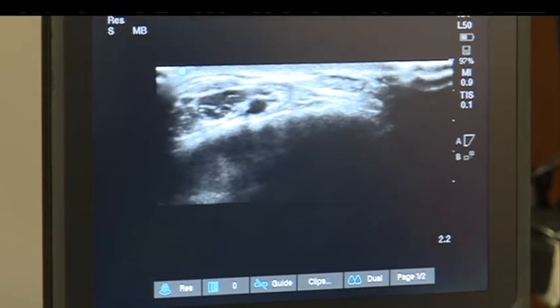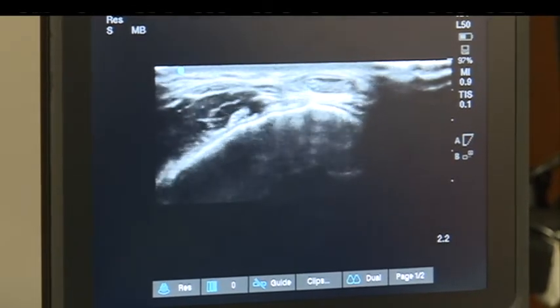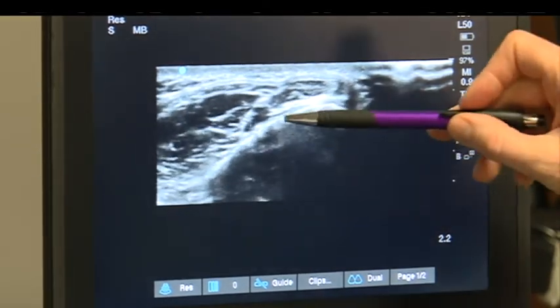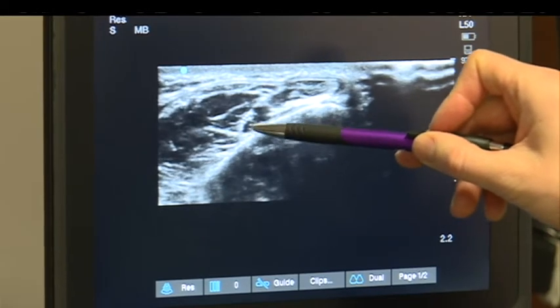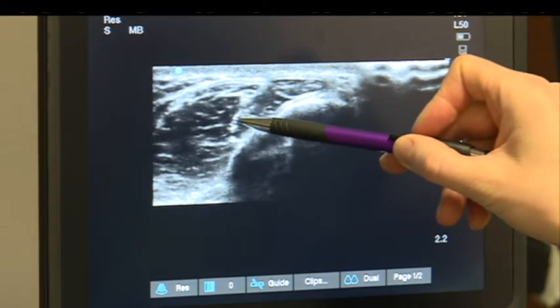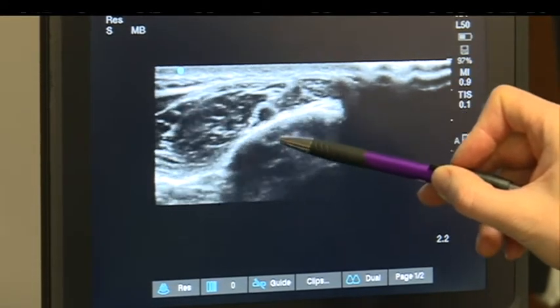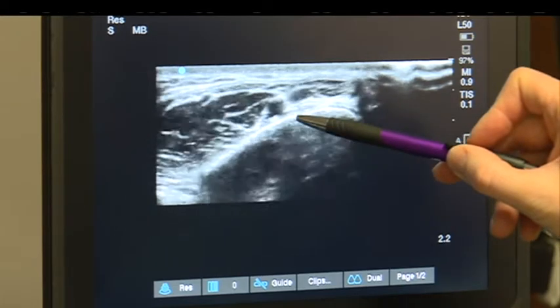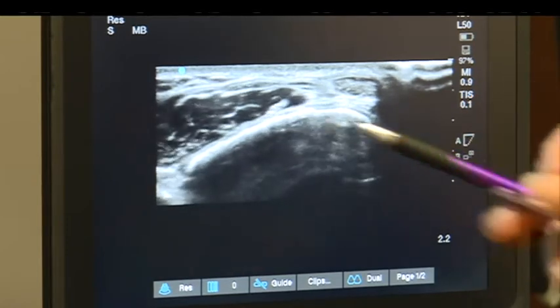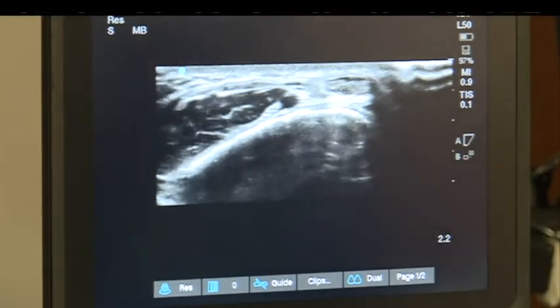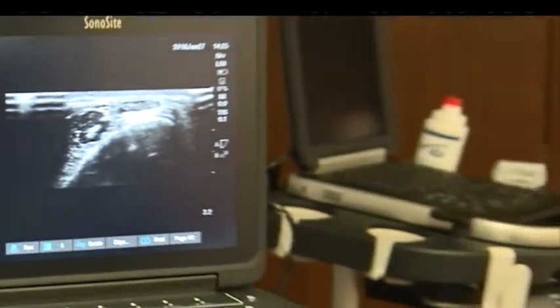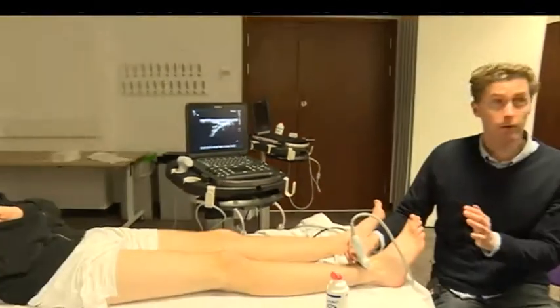Just sitting on the lateral side of the anterior tibial artery is a tiny little nerve — the deep fibular nerve, which supplies the first web space. Scanning proximally, you normally see it hook over the top of the artery — you get these little hypoechoic dots — and it rotates to lie on top of the artery, then rolls off to lie on the lateral side. It's an easy one to block from the lateral side, in-plane, with just two or three mils.